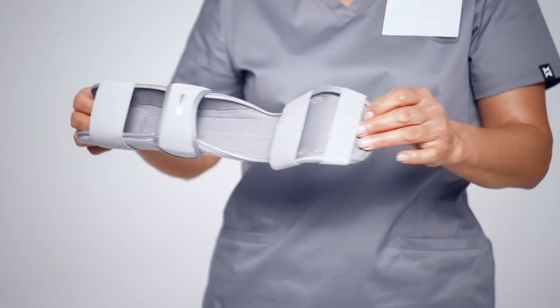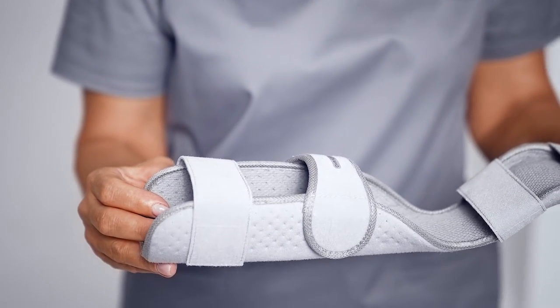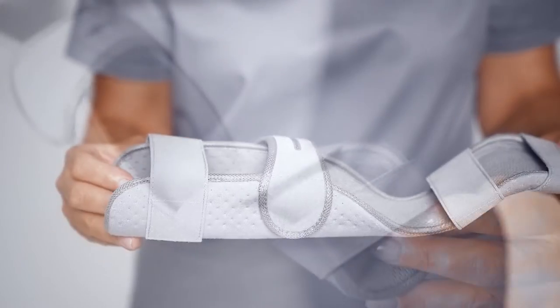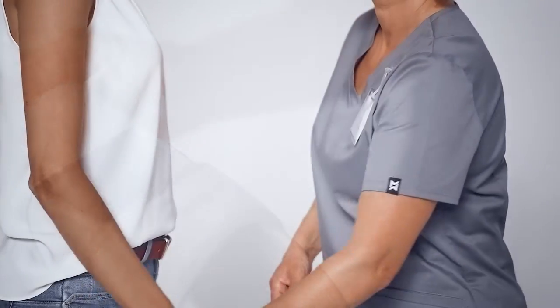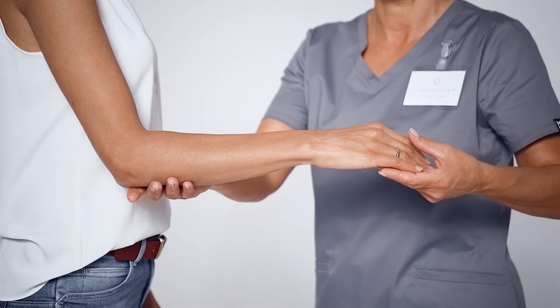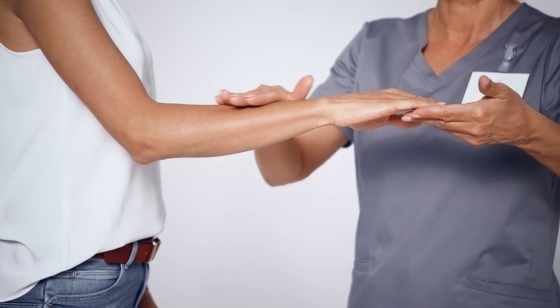Damage to the ligaments or tendons of the fingers and damage or degeneration of the ulnar side of the wrist have typical symptoms such as pain and a limited range of motion. Wearing a Chrysofix universal wrist orthosis may help alleviate the aches and pains that make daily tasks and sometimes even our nights uncomfortable or painful.